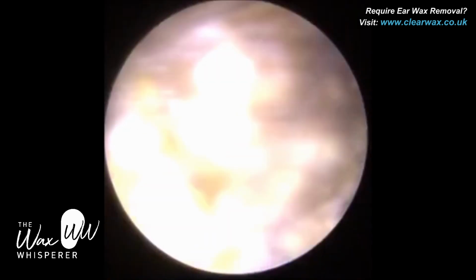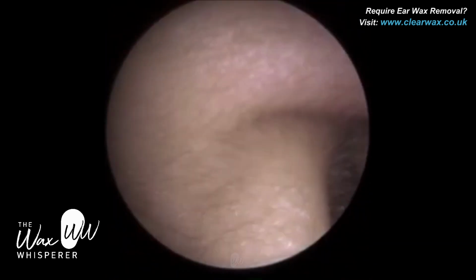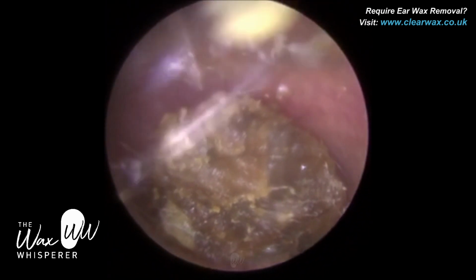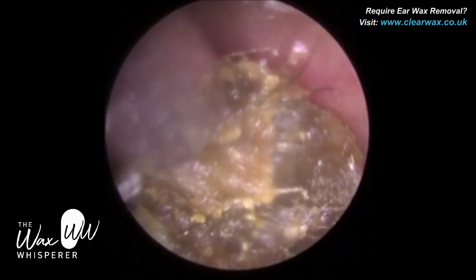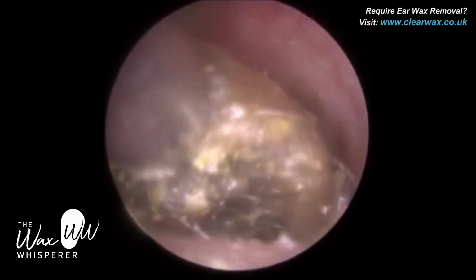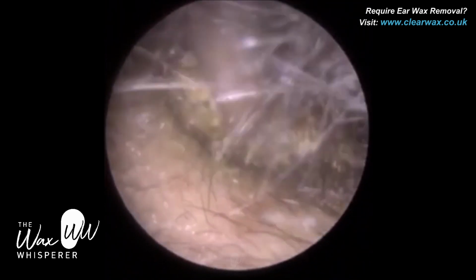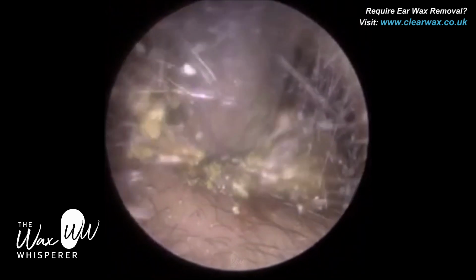And within the ear canal itself, you get narrowings and widenings. And again, when we remove wax, it's not as simple as just putting a suction probe into the ear and pulling something out. You have to navigate the bends, the narrowings, the widenings. So this plug of wax is a bit more medial, it's a bit sticky, so it's quite a stubborn consistency of wax. And you can see I was rolling it initially, bringing it past that second bend, bringing it forwards, and now I'm trying to wriggle it through the entrance.